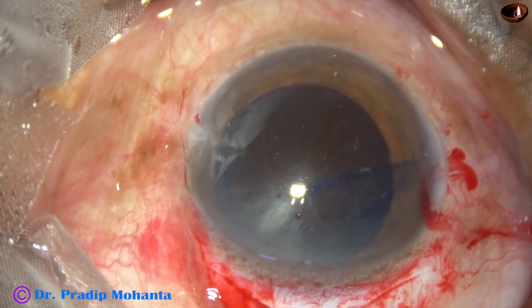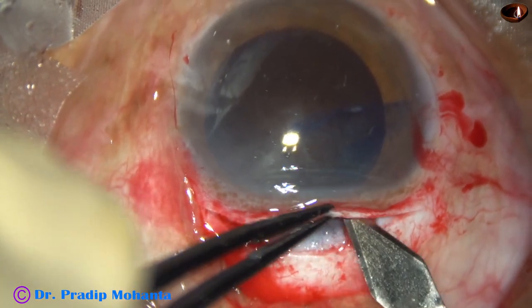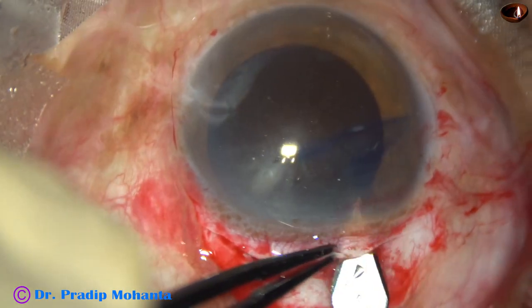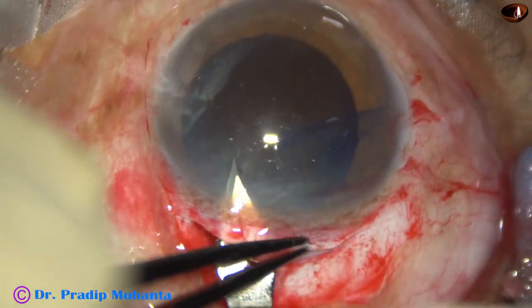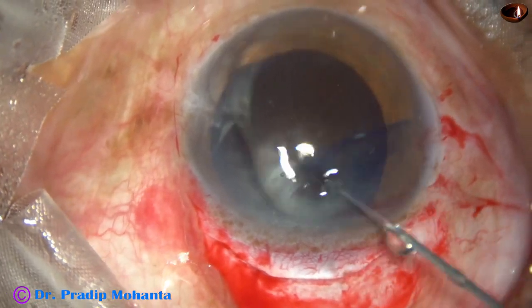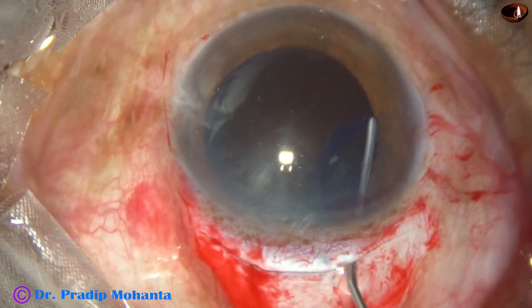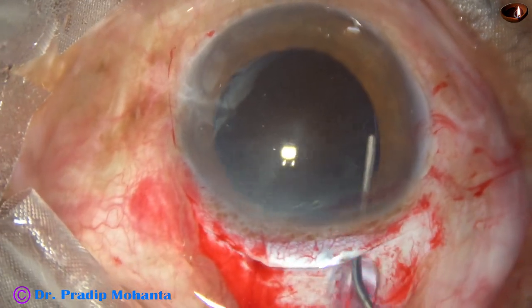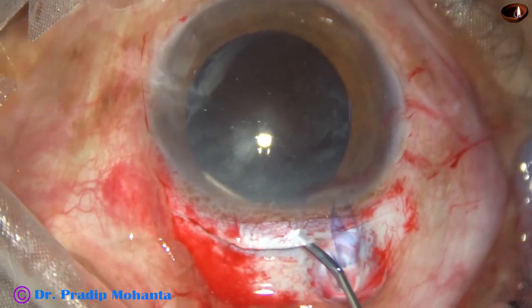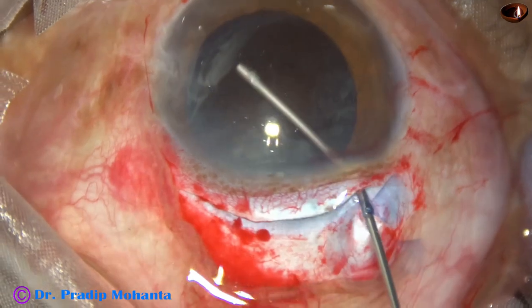Lift the anterior wall of the sclerocorneal tunnel with a tooth forceps, go to the anterior extreme of the wound and open the wound. Cut when we go forward as we do in SICS so that we get a very nice corneal valve. And now hydrodissection is done, and I'm trying to prolapse the nucleus by hydrodissection, but it didn't happen. It's a huge nucleus. Though the capsulotomy is large, it is not enough for this huge nucleus.